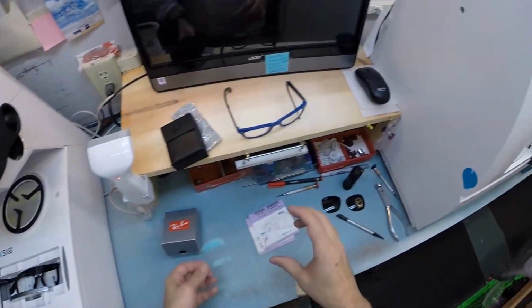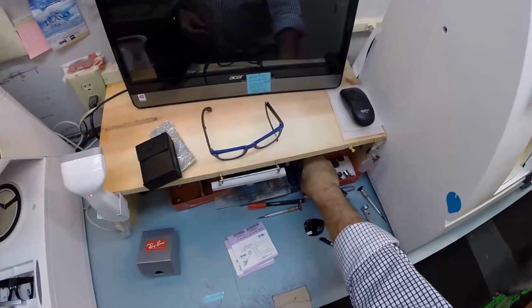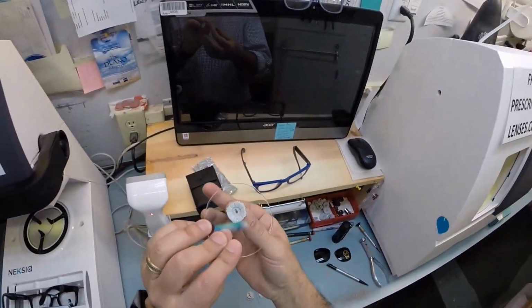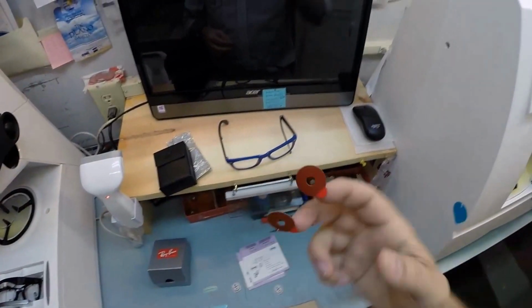Okay, so I'm going to come back down here. I'm going to take the right lens and place it onto the platform. Now this is a block, or as I like to call them, Jenny from the block. I need to attach this to your lens while it is cutting. So I need to use a double-sided adhesive sticker to do that, of which I've got two up here. I'm going to pull these off. The black side is the sticky side.